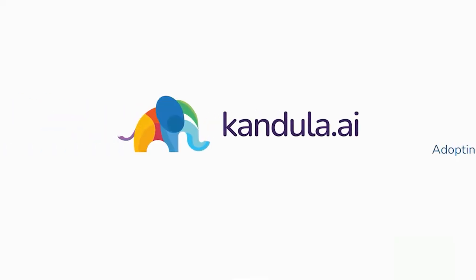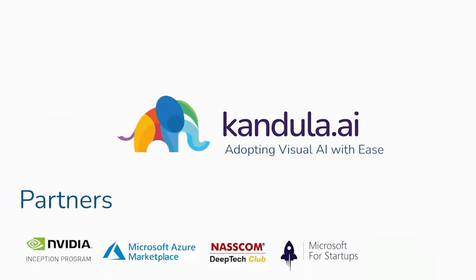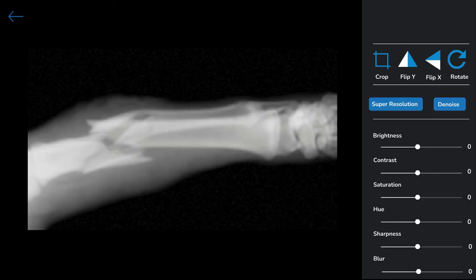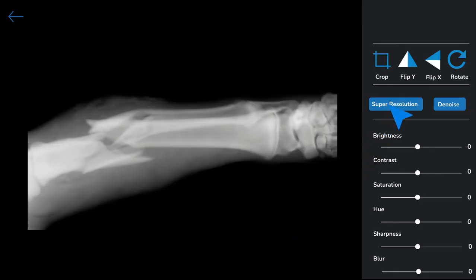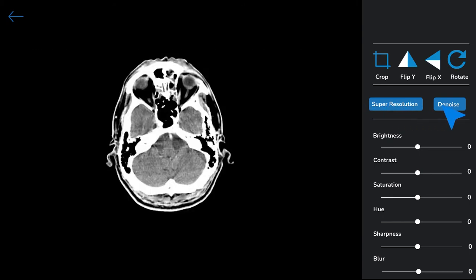Introducing Kandula.ai — one platform for all your visual AI needs. Kandula has an interesting feature which is super resolution and denoise cancellation, which helps to make images go from low quality to high resolution medical images.